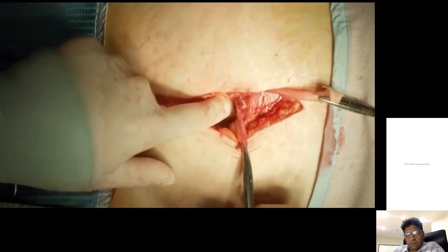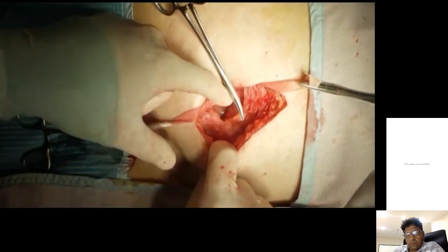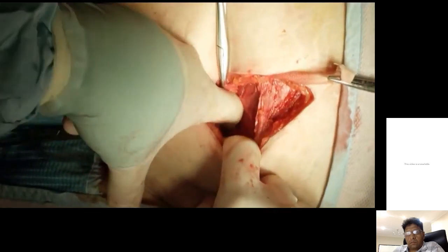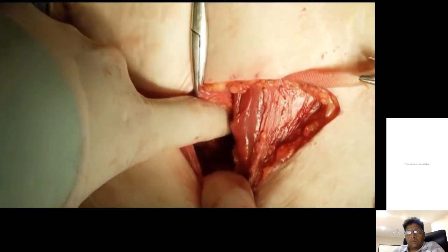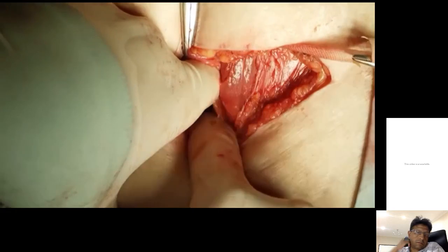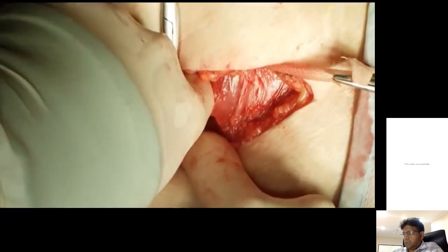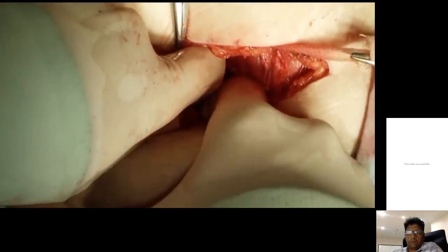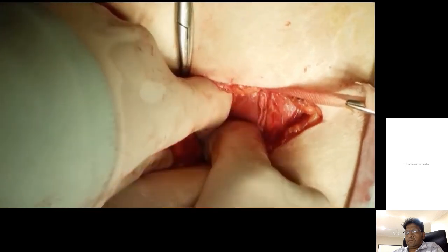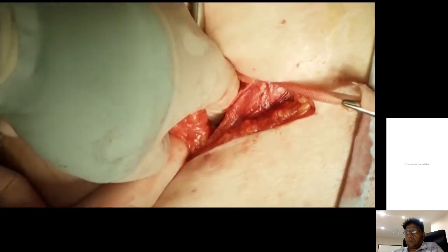So whilst we're letting the bowel decide what it's doing, we can look at repairing the femoral defect. Two ways of doing this. One is with stitches, and the other is with a mesh. In the presence of the small bowel being incarcerated in here, it's sensible to just close with stitches. If you can't reduce the sac completely, you can just amputate it extraperitoneally.